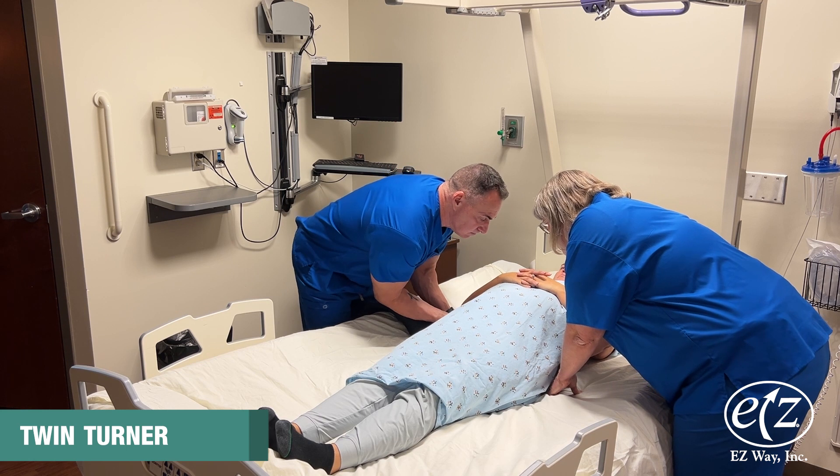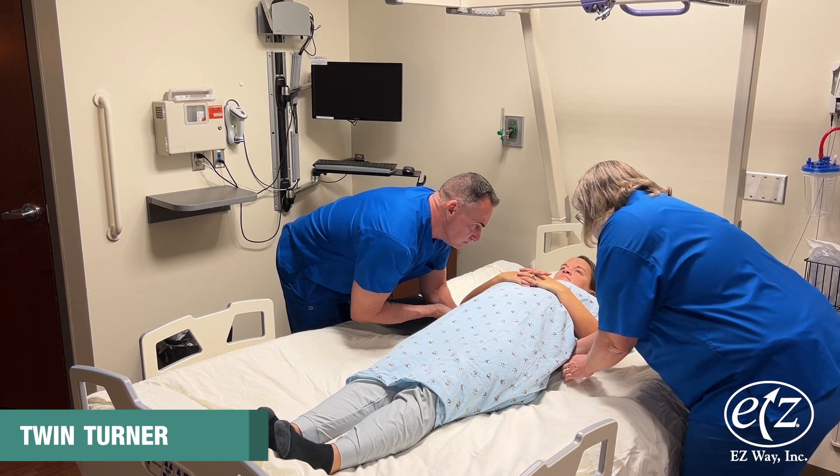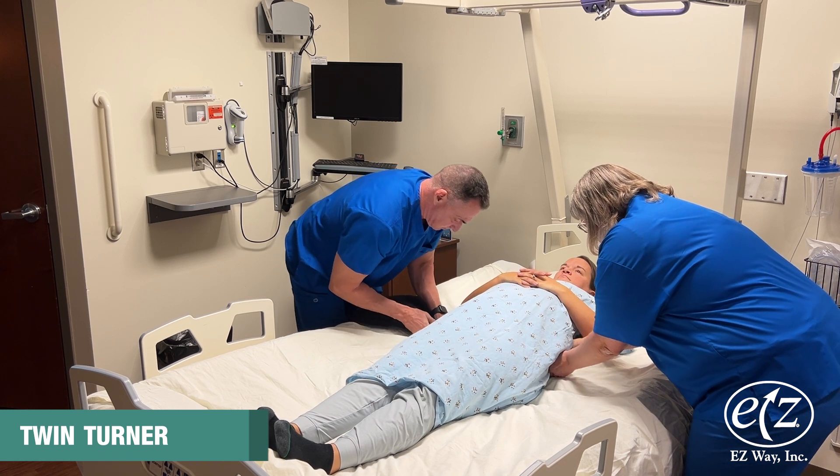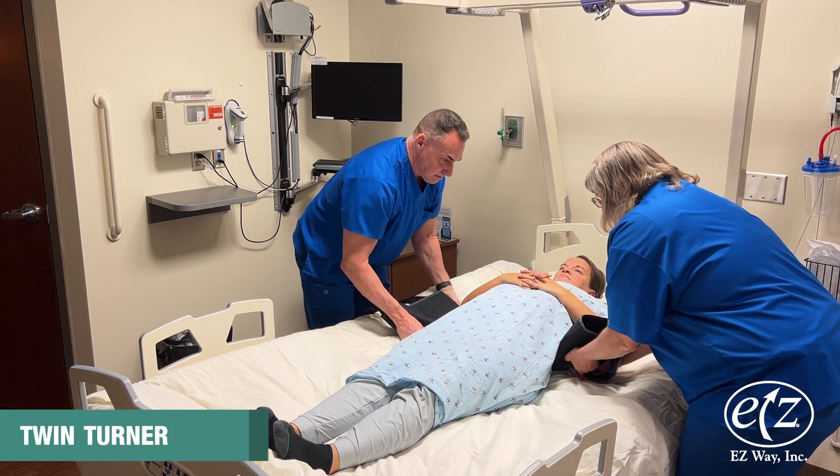For ease, it may be beneficial to have a second caregiver depressing the bed on the opposite side. Pull out the folded portion of the sling on the opposite side of the bed.